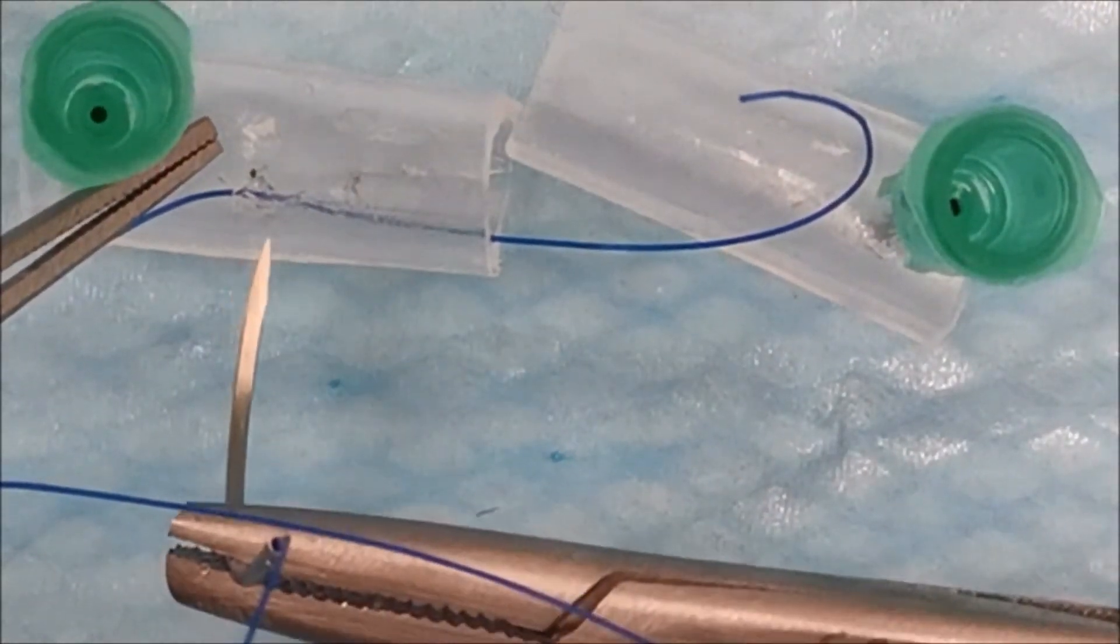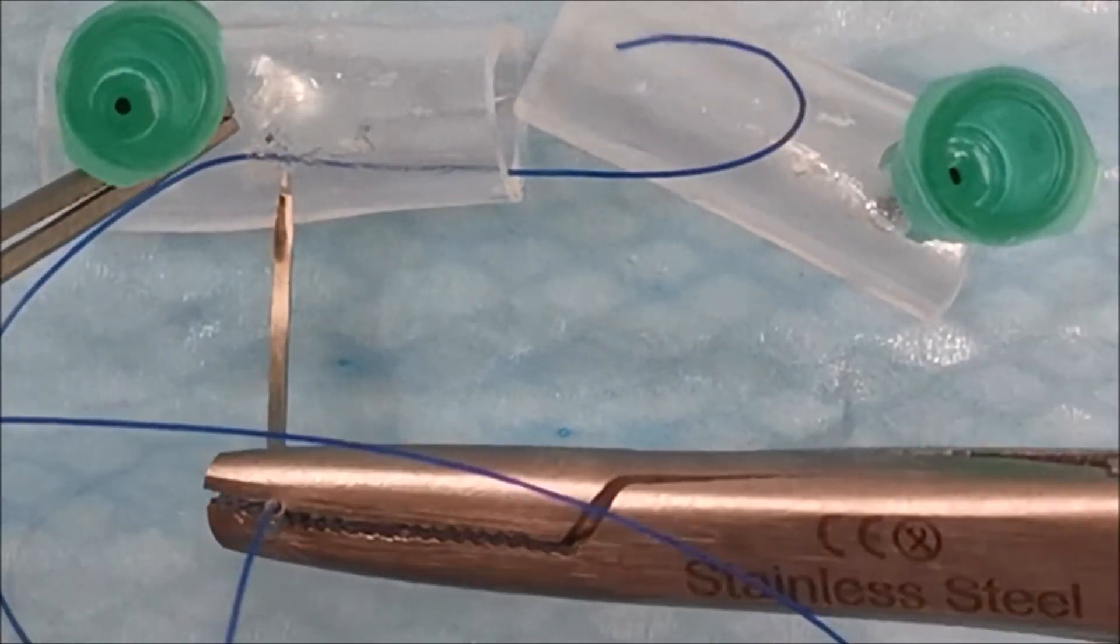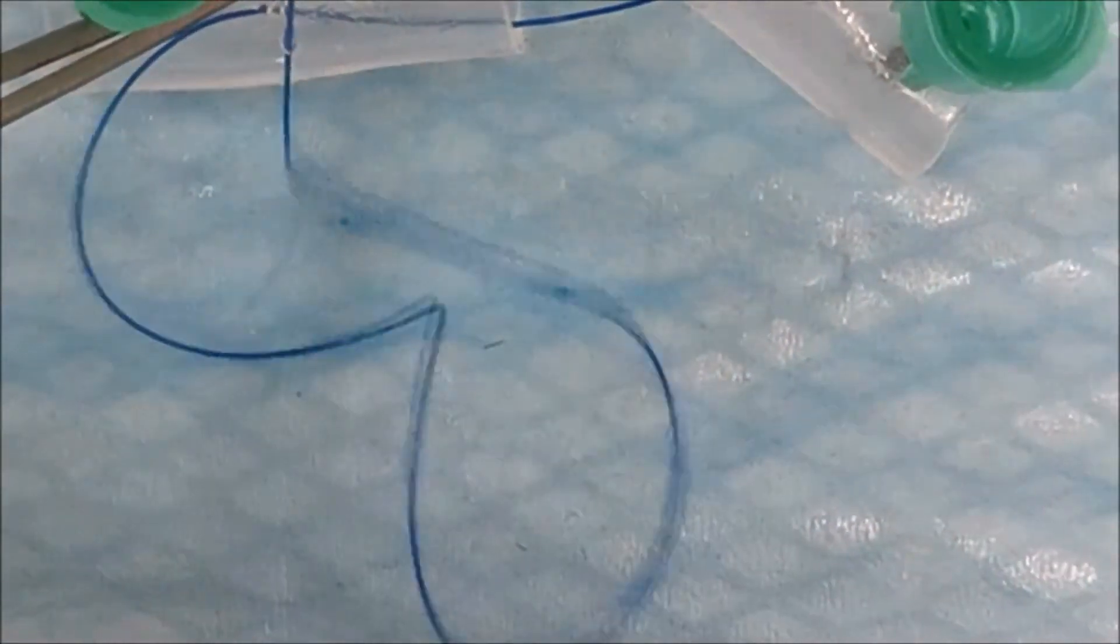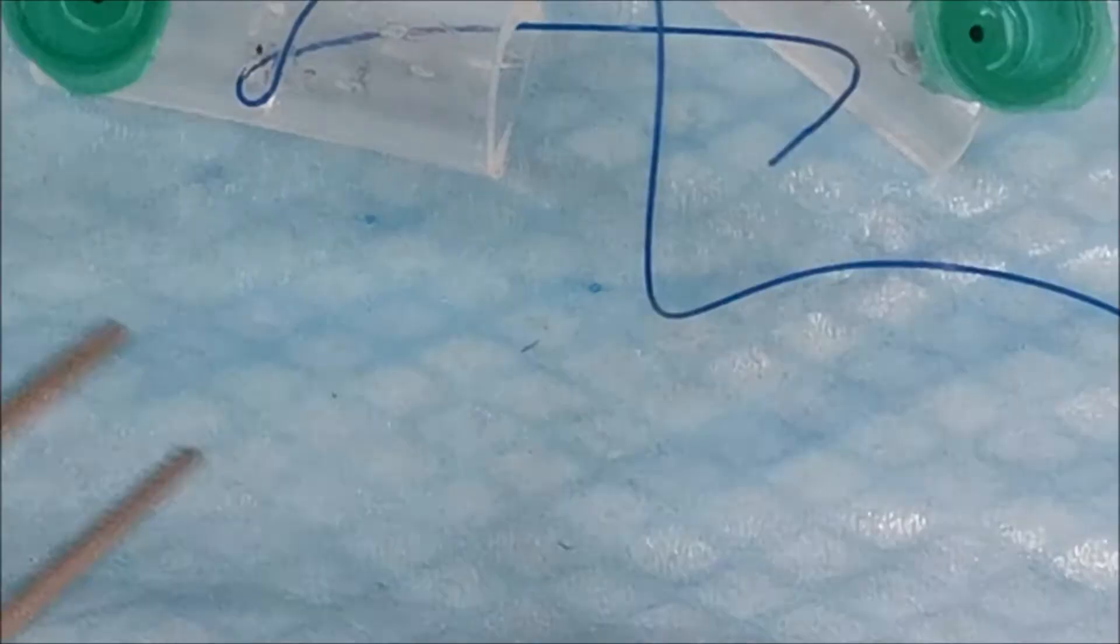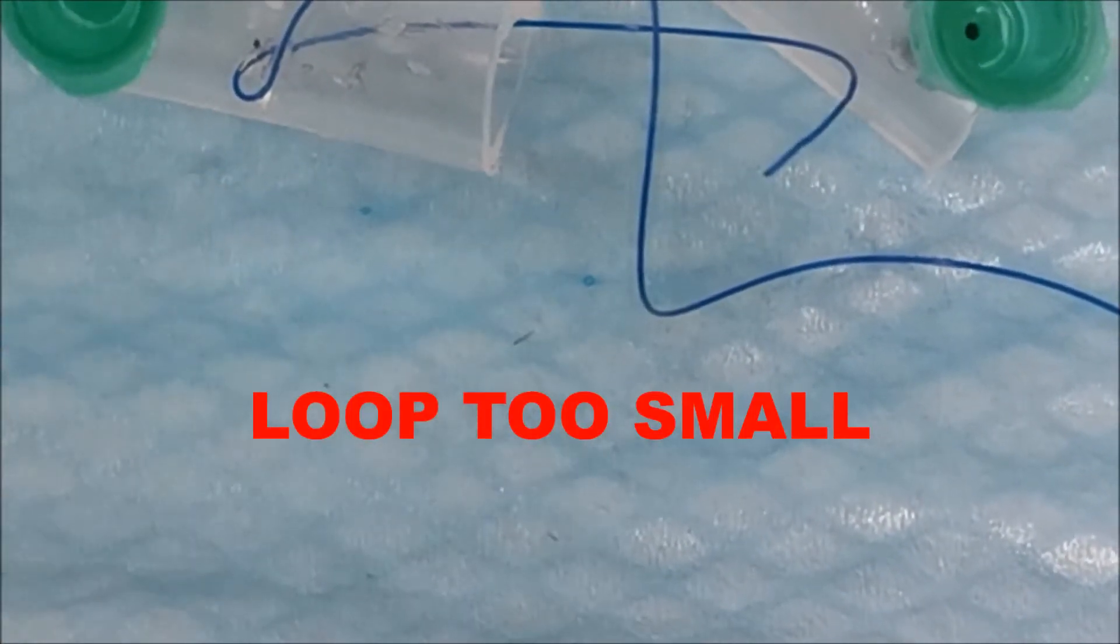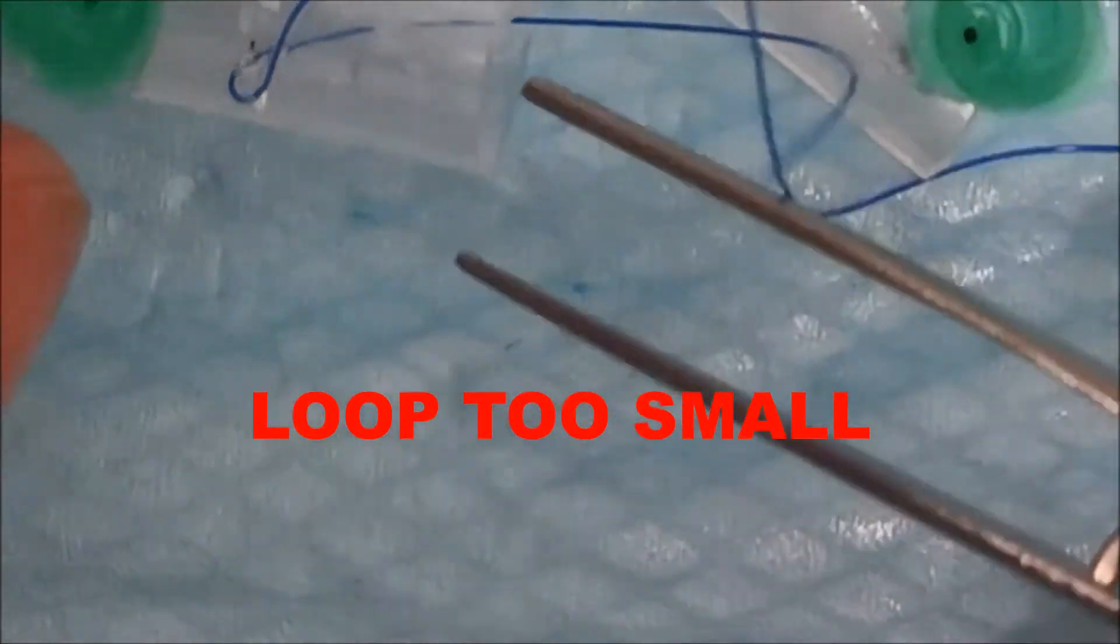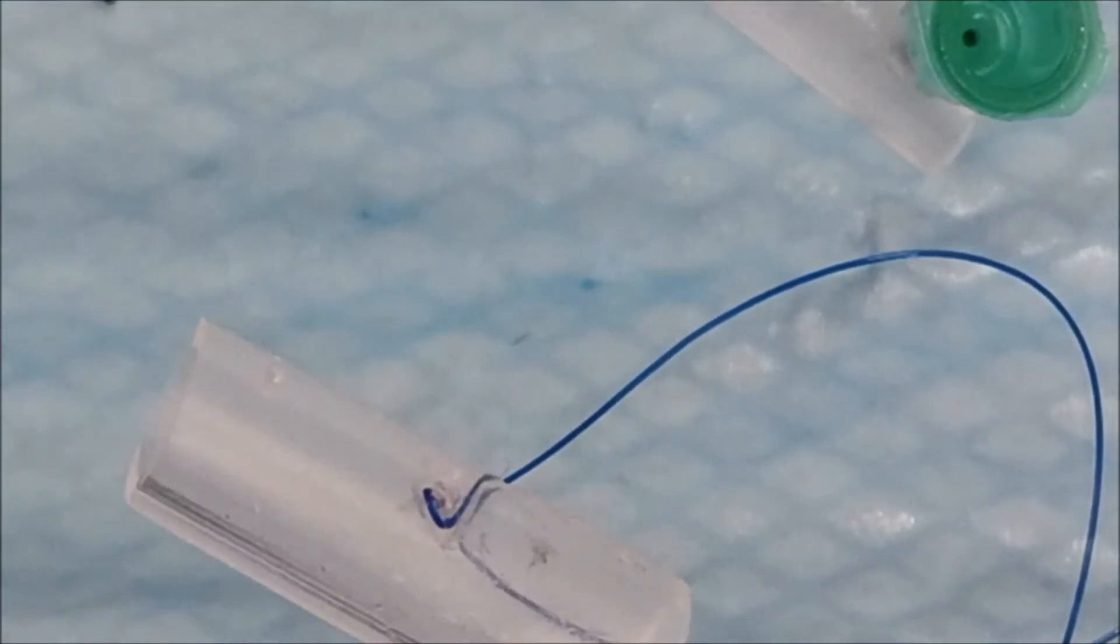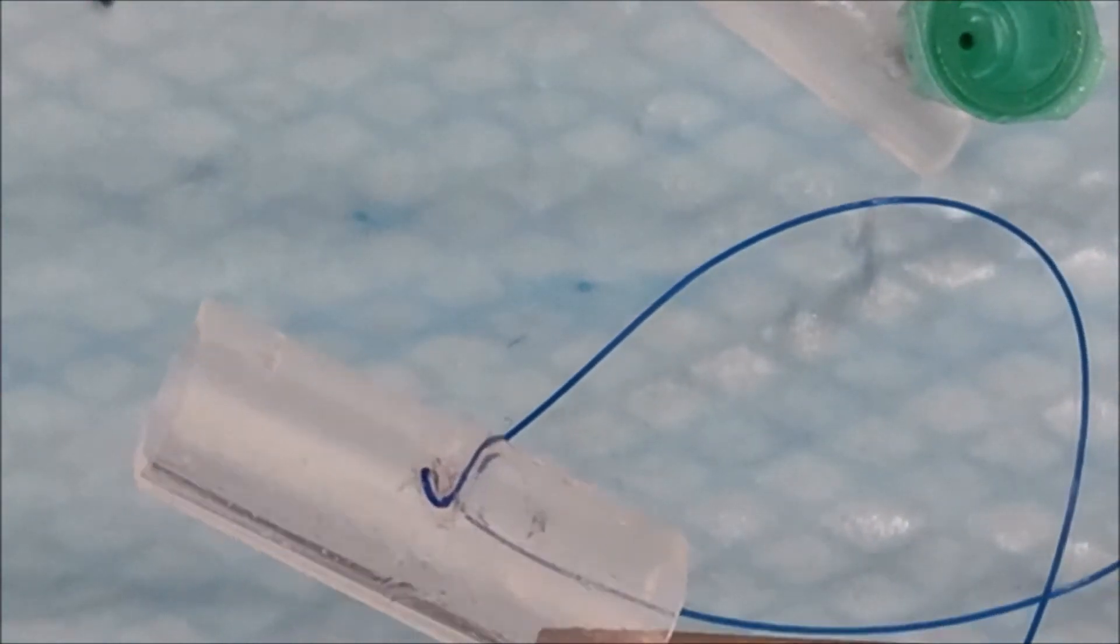Another common error is actually making your loop too small. If this happens, you're only grasping a very small percentage of fibers. If you look at this from the lateral view, you can see how many fibers you'd actually be grasping with that little loop.